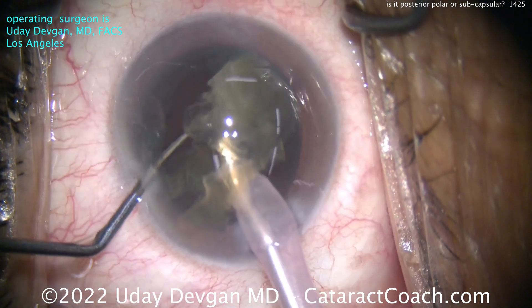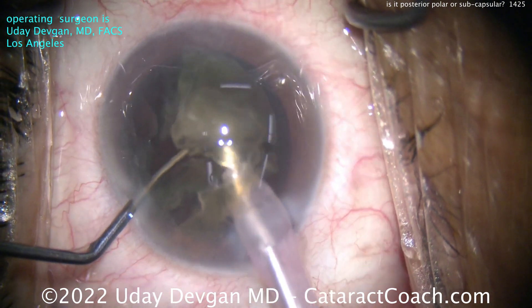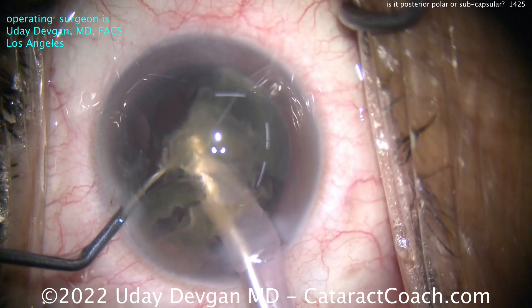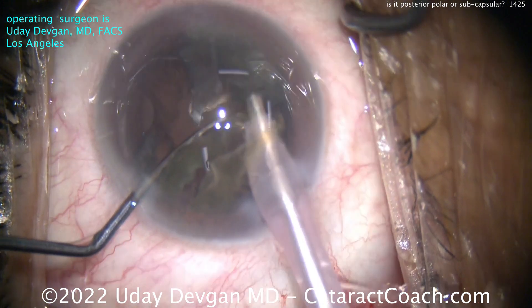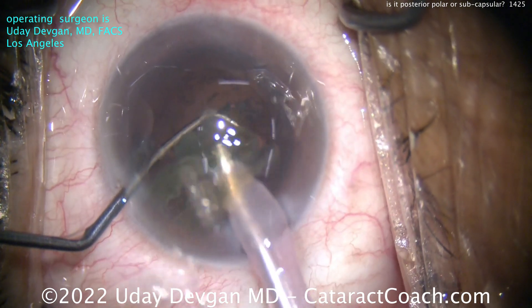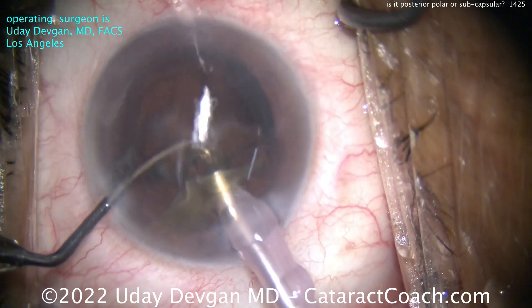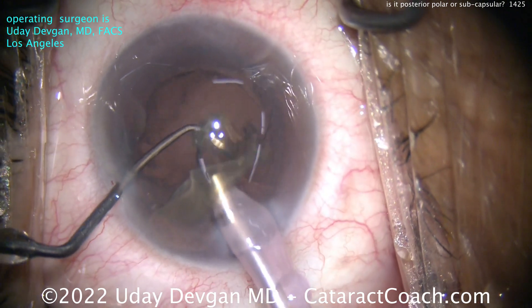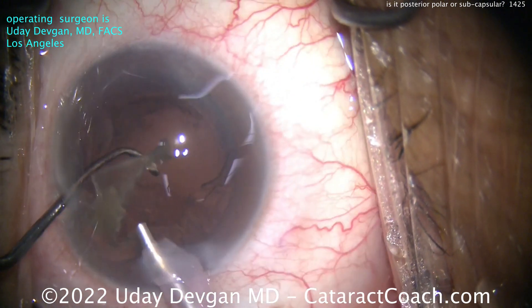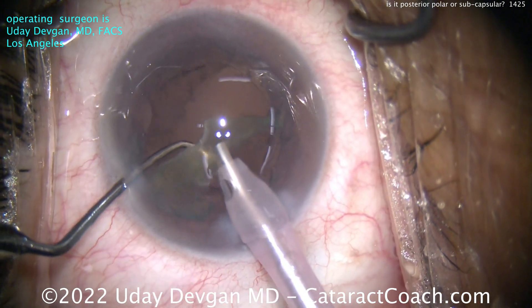Let me make sure — so far nothing's falling back. It seems pretty stable; there's good motion throughout the AC. The pieces aren't getting stuck; I don't hear vitreous occlusion on the machine — I'm pretty happy. But this is a case where as I'm doing it I'm just thinking: what if this was a posterior polar and I missed it or denied it and made the decision for PSC? If that's the case I may be in trouble. But now we're in the eye — let's just get the nuclear pieces out. Focus, focus, focus. Keep the chop in that safe position; don't let any pieces fall back onto the macula just in case the bag is open.